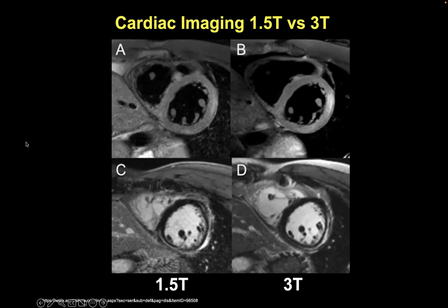And in fact, the trend over the last, I would say 7 years, is to drop this down to 0.5T, because then you can run pulse sequences that don't really run very well at 1.5 and 3T, that use a lot of RF pulsing. You have to eliminate a lot of the RF pulsing at 1.5 and 3T because you're going to heat up the patient, whereas you can use it at 0.5. And so the signal to noise loss is less, right? You're going to lose signal to noise as you go down in field, but you can pulse a lot more down here at 0.5.